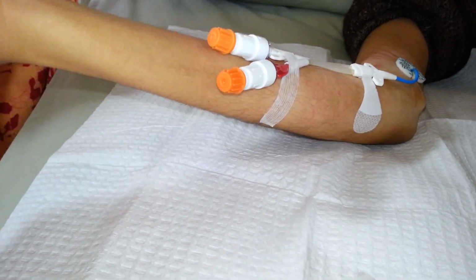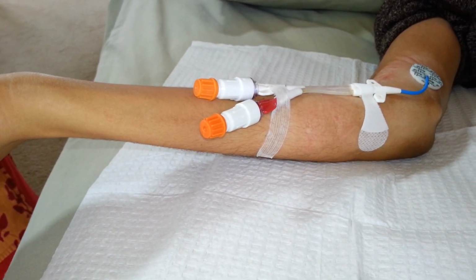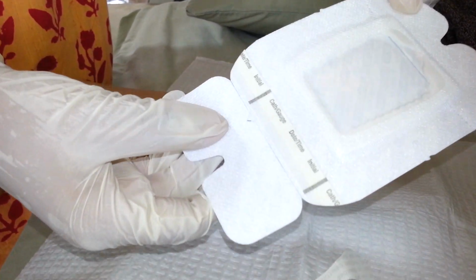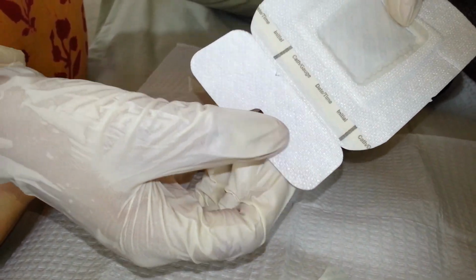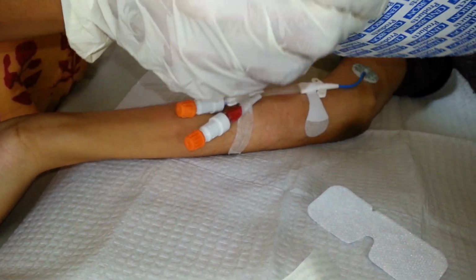Also, we make sure that my catheter is in a C shape before we put the dressing. And now we will put the dressing. So above you, it's very simple. Separate the bottom part and put it aside. Remove the dressing cover by peeling it off.